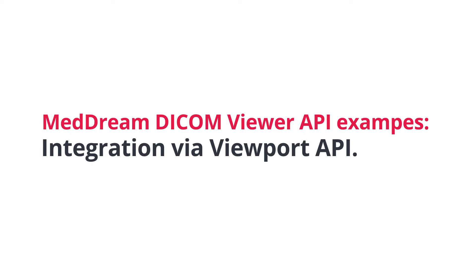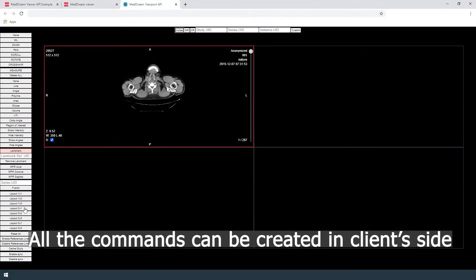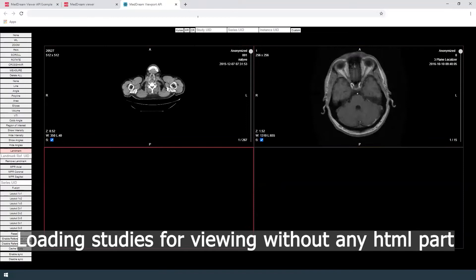MedDream.com Viewer API examples: viewport only integration into the client's system. This is a sample page where the client can integrate only the viewport into the system. All the commands can be created on the client's system side. Loading the studies for viewing without any HTML part.